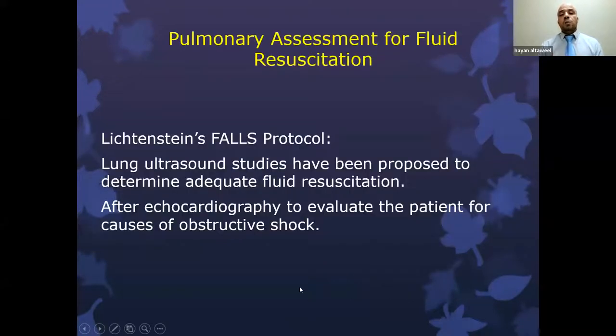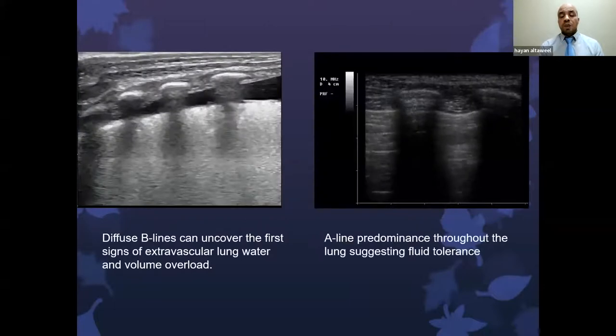Next, we'll go to the pulmonary assessment for fluid resuscitation. Lichtenstein proposed a good protocol, the FALLS protocol, using lung ultrasound. Studies have proposed it to determine adequate fluid resuscitation after echocardiography to evaluate the patient for causes of obstructive shock. We have two examples of two patients.